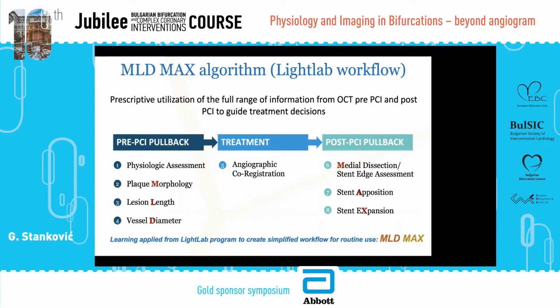Abbott, with the LightLab workflow, is trying to promote all this knowledge and all this experience in the workflow named the MLD MAX algorithm, which tells you the reason to prospectively use the full range of information from OCT for pre-PCI, during-PCI, and after-PCI decision making. So the pre-PCI pullback can help us with physiologic assessment, but most importantly with morphology, length, and diameter of the lesion. Then we can plan the strategy.